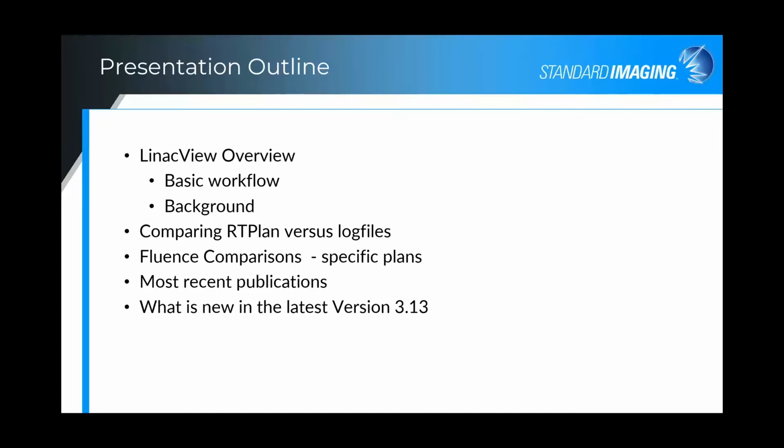Then I will discuss a few recent publications comparing log files versus detector arrays. Finally, I'll review some of the new features in recent releases and then summarize.